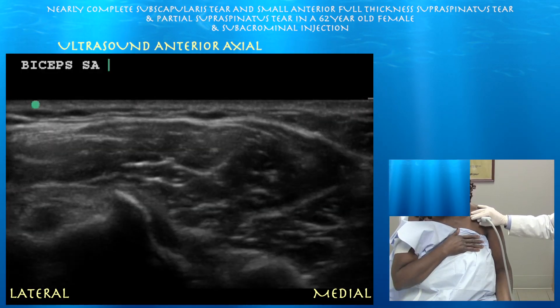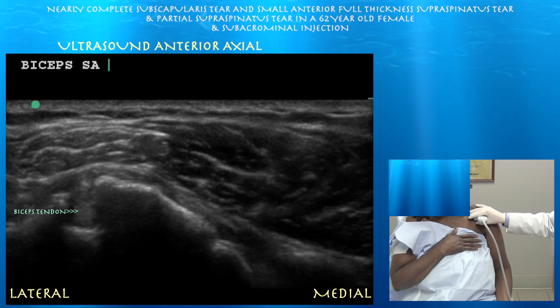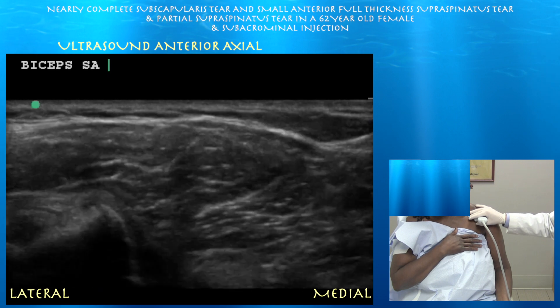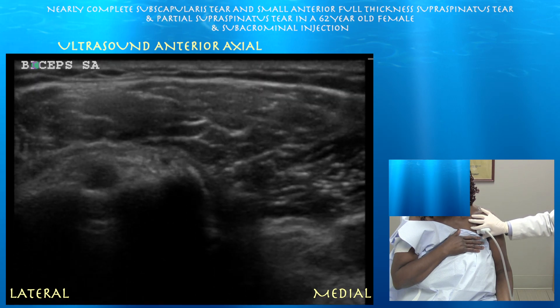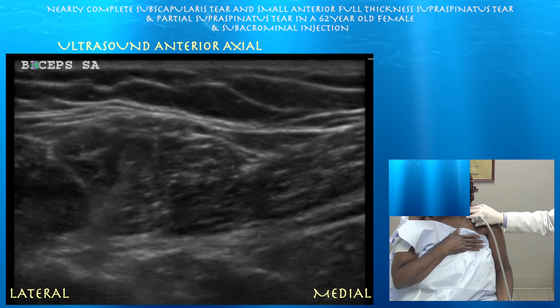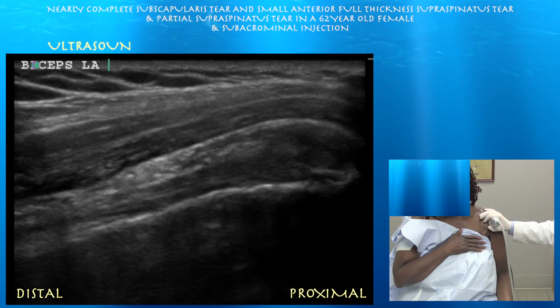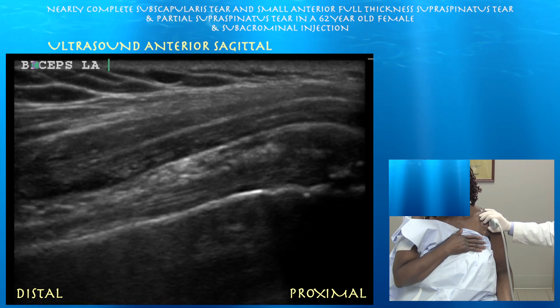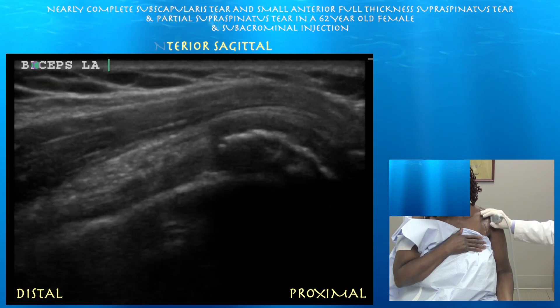We can see the biceps tendon here in the groove. Right side of the screen is medial. Here's a pretty clear view of the biceps tendon just sitting in that sulcus. We're at approximately 1359. Pec major tendon is visible, and we're moving up. Here's the biceps now in the long axis at 1400. The biceps tendon looks normal here in the long axis.